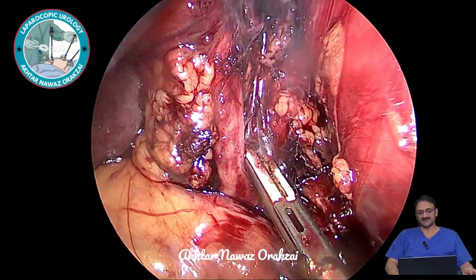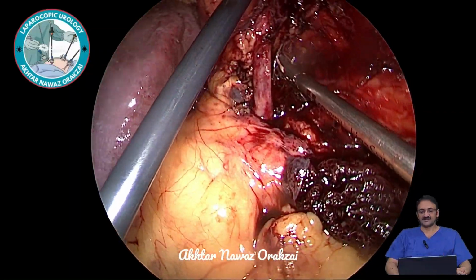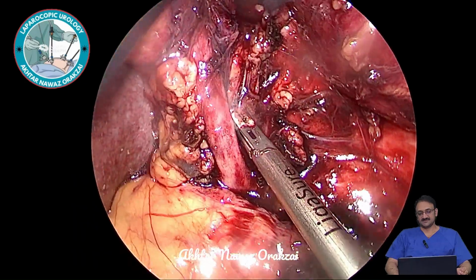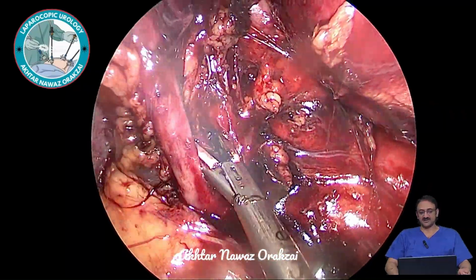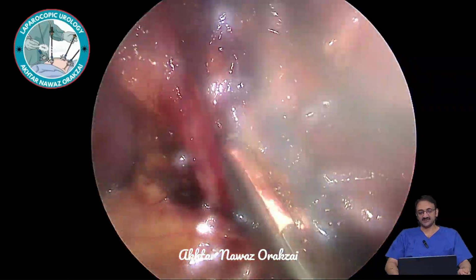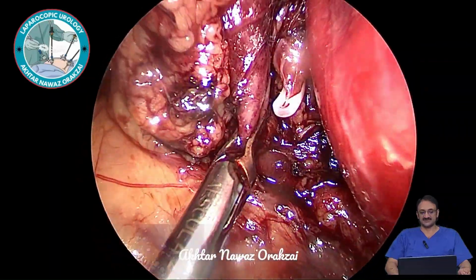So it is here that it happened. We cut the tissue without realizing that there might be the renal artery or one of its branches. And the thing that we thought was the renal artery turned out to be a lymph node. So we clipped that suspected artery.